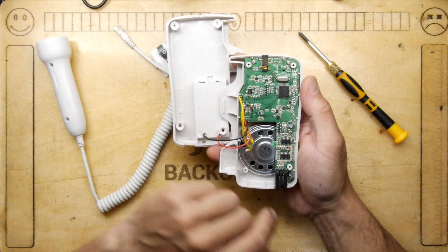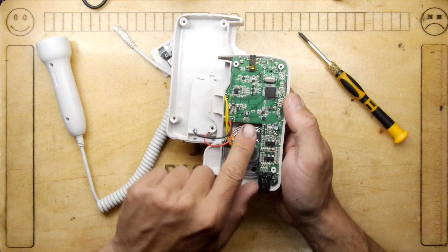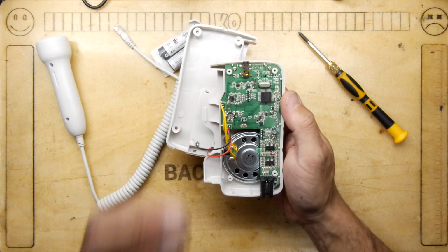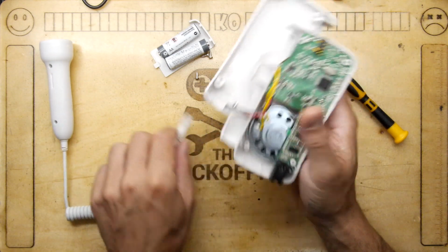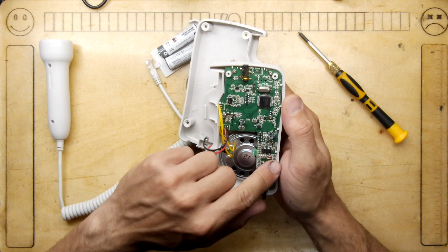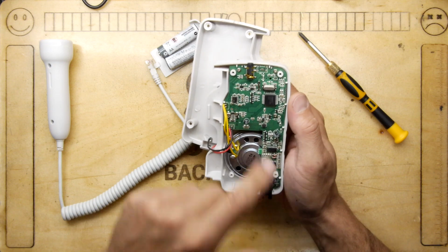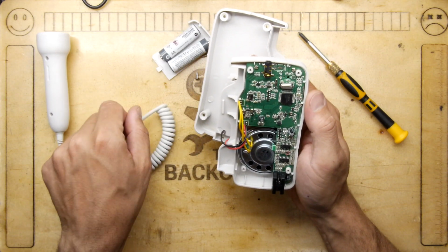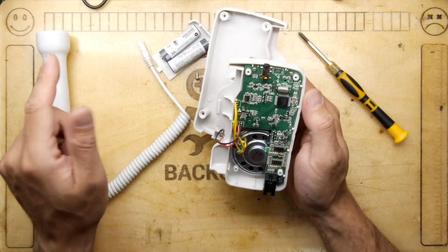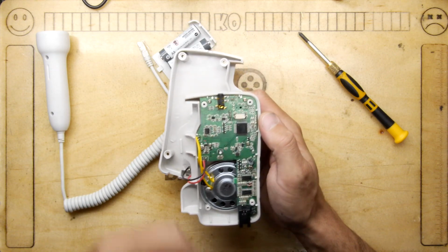So we have quite a large speaker for a device from the Far East, probably just a few quid. You've got a decent, I think it was like an RJ12 type port, and it's going through LM324s, whatever they are. So they're obviously conditioning something. They're probably just driving this for a bit of power, and then obviously picking up the response. It's working like a radar. It's sending a signal out and then detecting that back, bat ear style.